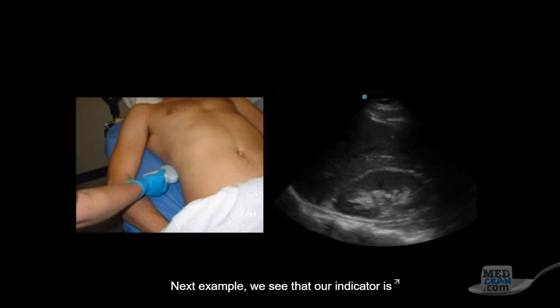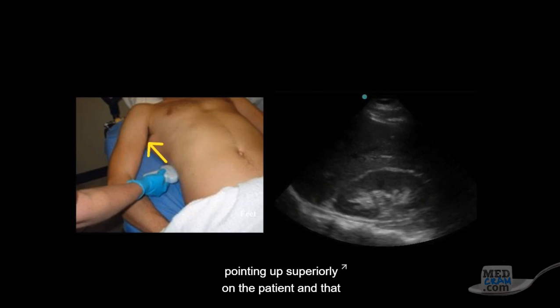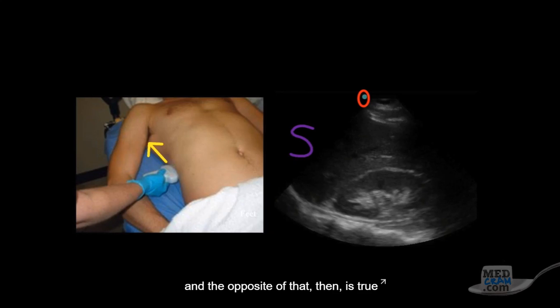Next example, we see that our indicator is pointing up superiorly on the patient, and that our indicator on the ultrasound screen is on the left. Therefore, the left side again is superior, and the opposite of that then is true where the right side is inferior.